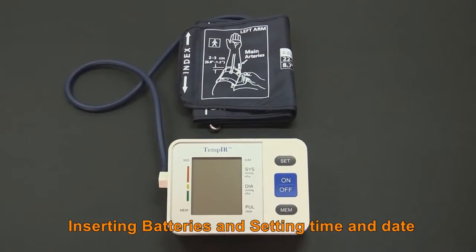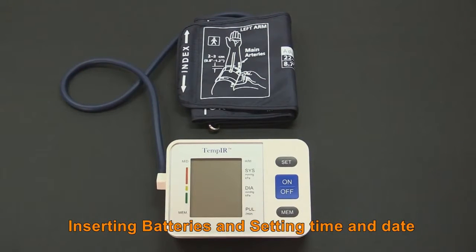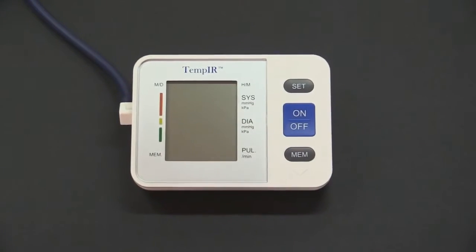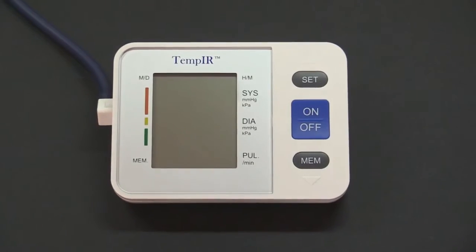The TempIR Upper Arm Blood Pressure Monitor is ideal for personal domestic use. It is both safe and easy to use and can help you keep an accurate record of your blood pressure.